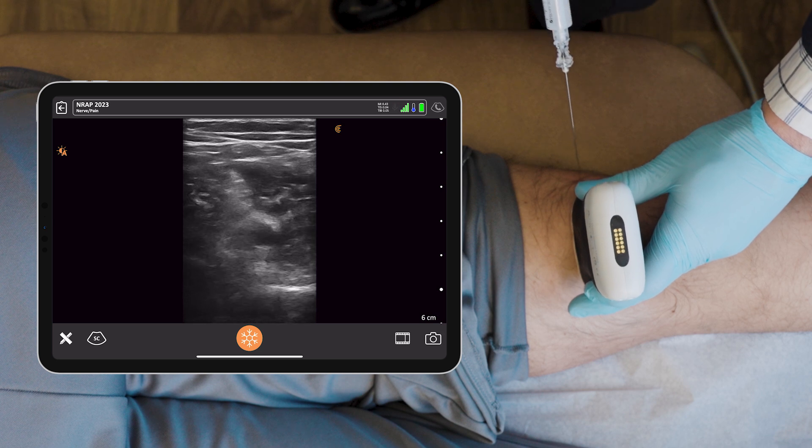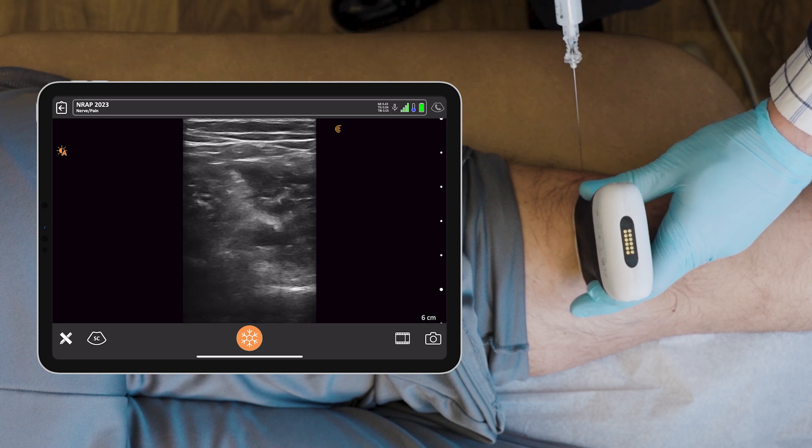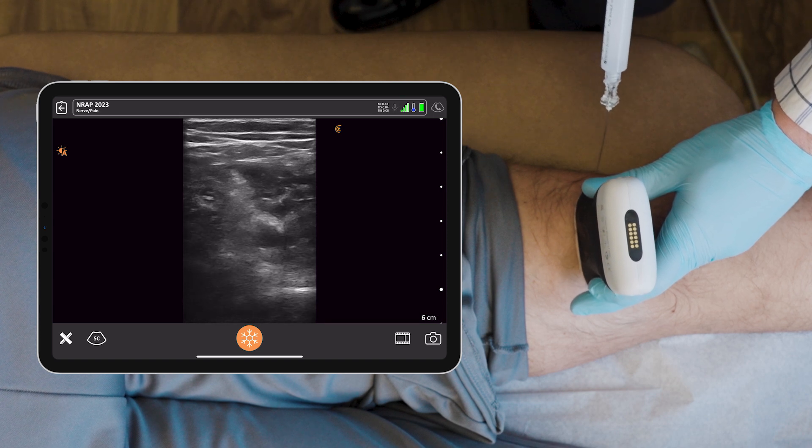Okay, you're going to feel a little pinch here, okay? Anything that shoots down the back of your leg to the foot, let me know please. Pinch. You're alright?